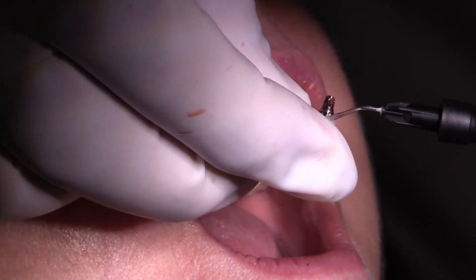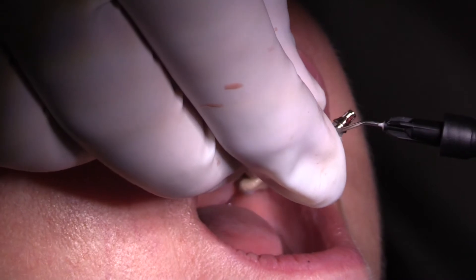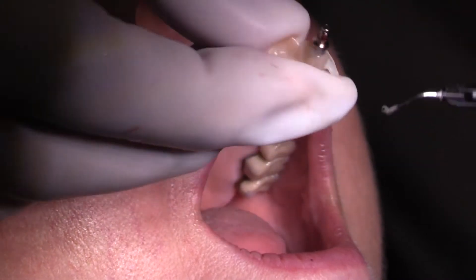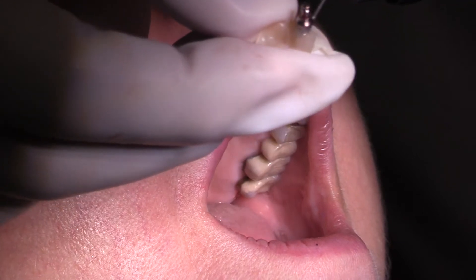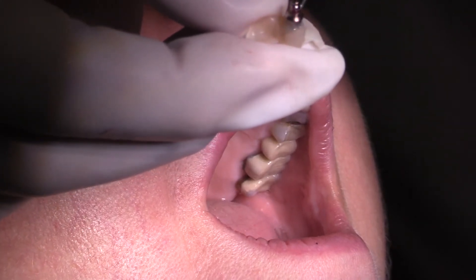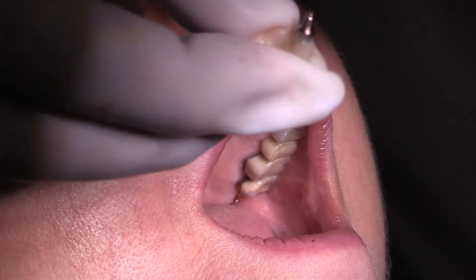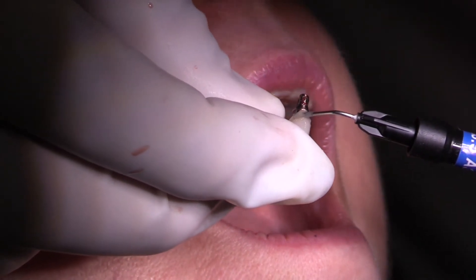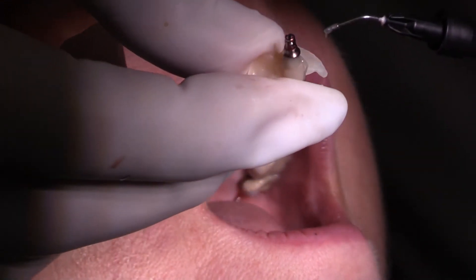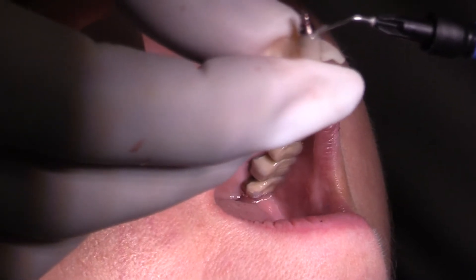In this case there's not much need for bone graft — we have a very tiny root surface that was taken out, so there's really no spot for bone graft. Here you can see I'm applying some resin to seal off the gap from the temporary abutment to the temshell, making sure it's not flowing too much over the cylinder itself, but coming around the outside and then curing this outside of the mouth.